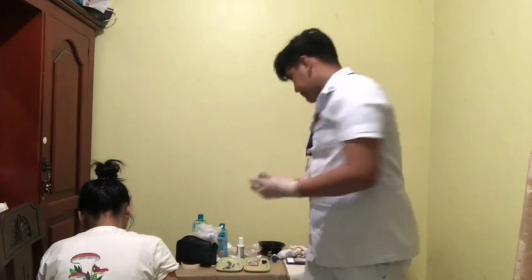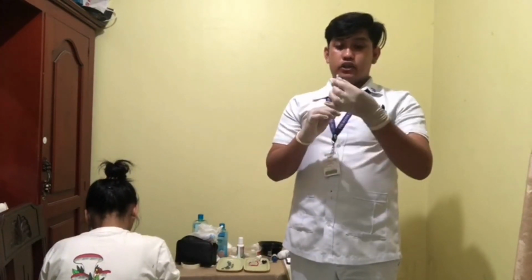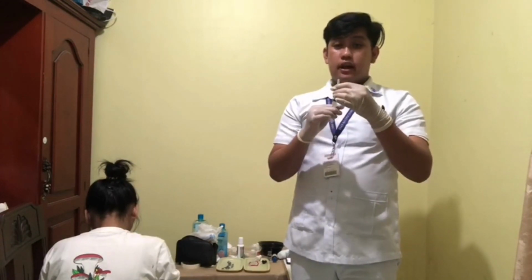So then we'll get the syringe for injection. So we have the syringe with the medication withdrawn from an ampule. So the syringe needle has also been replaced, as you can see. And now we'll remove the cover of the needle, and carefully, without contaminating, we should also be careful not to drip medication on the needle prior to the injection.